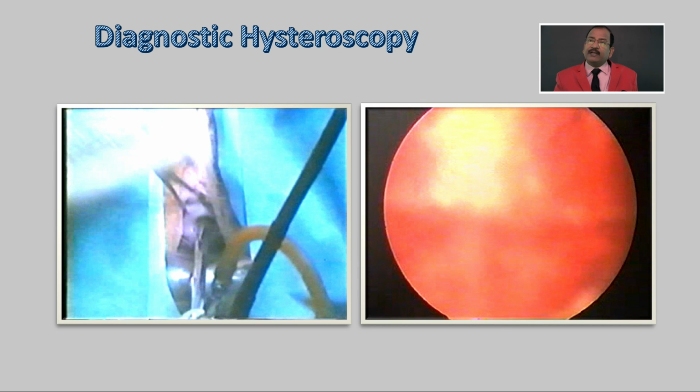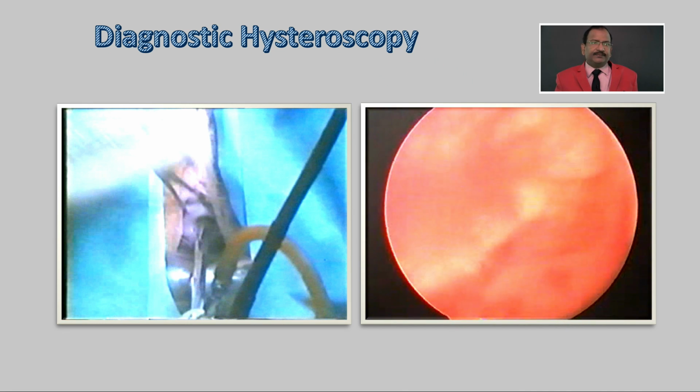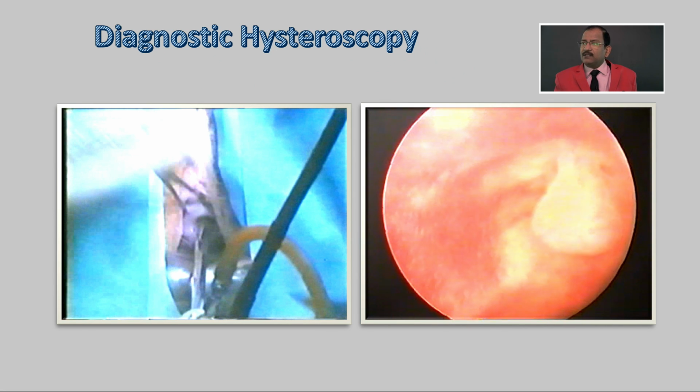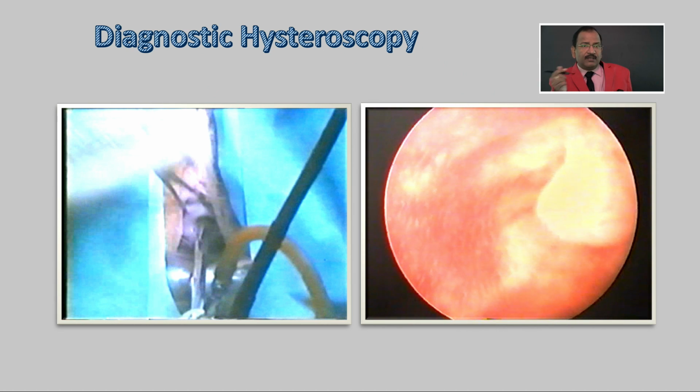Initially the fluid will be dirty. So if you have a double channel, open the exit channel, it will wash out the cavity. If you have a single channel, then detach the input and let the fluid come out from the same channel. Or if it is loose, it is already leaking. Within a few seconds, it will become clean, like this. It is clean, because fresh fluid will come, and dirty fluid comes out.